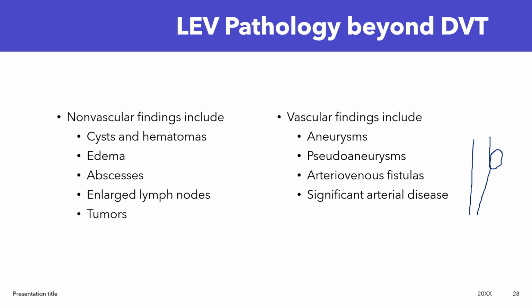Even though we're not focusing on the arteries, we're really following the whole arterial system down because it travels with the veins. And so sometimes you will identify severe disease there. And oftentimes it would not be within your scope to extend the exam into an arterial study, but definitely making notes on that, so they might want to order that study at a later date, would be prudent.